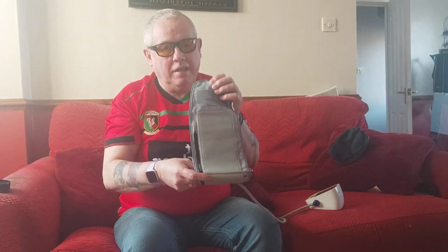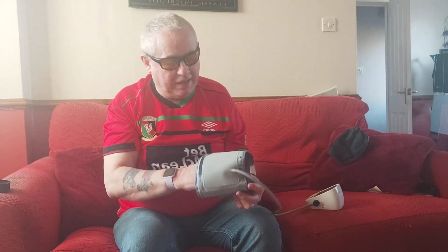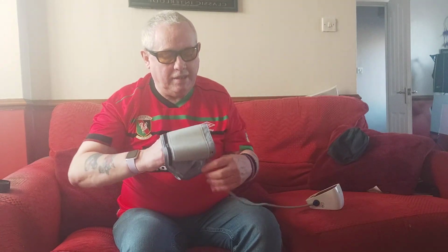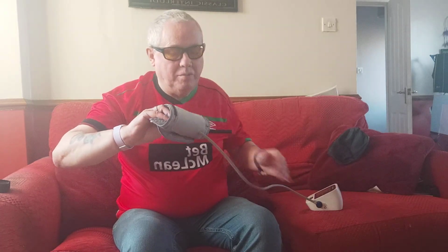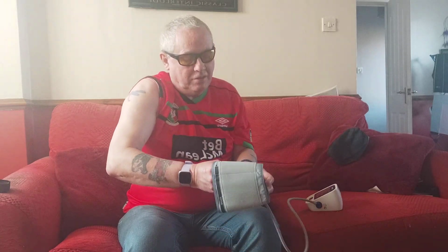And as you can see, it goes to any length, so it doesn't matter what your arm size is or anything like that. I always make sure that the lead that's leading down to the blood pressure machine is at the bottom when I'm putting the cuff on. So I always roll my sleeve up as so. You actually don't have to. You can take your blood pressure over the likes of a thin top, but I just like to take it like this. And I always take 2 readings.